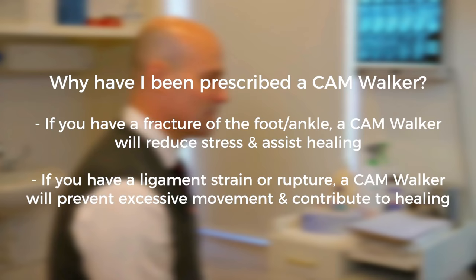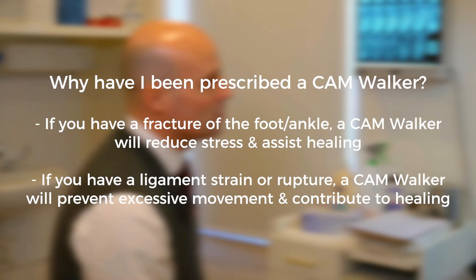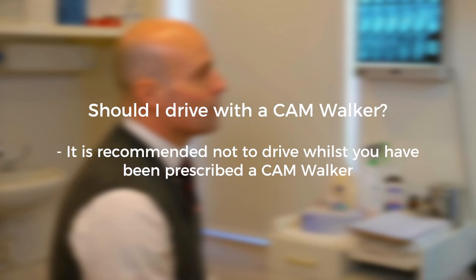For ligament or soft tissue injuries: if you have a more severe ligament or strain rupture, it will prevent excessive movement of the affected ligament and contributes to stability for rapid healing. Regarding driving, it is recommended not to drive whilst you have been prescribed a moon boot.